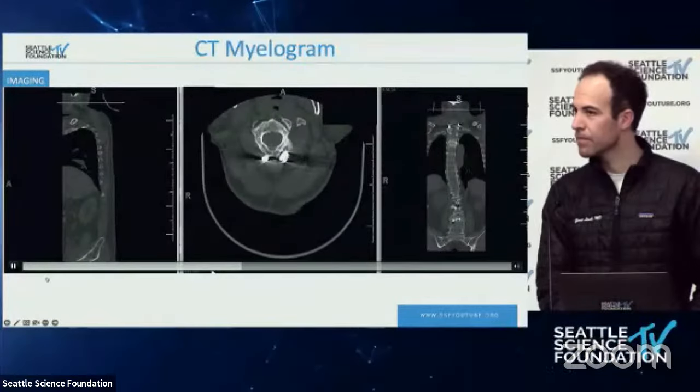You know, I think that's the issue with minimally invasive. It doesn't let you be lazy, you know, to not do a good construct. And so I think probably just not adhering to your basic biomechanical principles, stopping at a mobile segment there. And then with the, having a little difficulty, hard time making out the cervical thoracic views there.